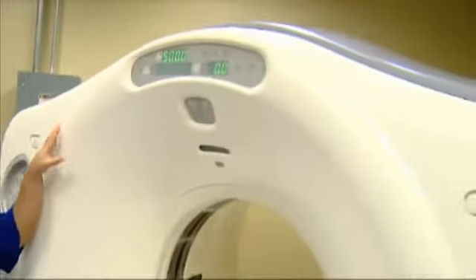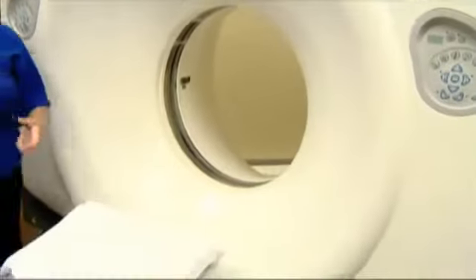Well, this machine may seem overwhelming, but really it is not that invasive. And of course, Dr. Grieves joins us and he's going to tell us all about the CAT scan. Thank you so much for joining us.